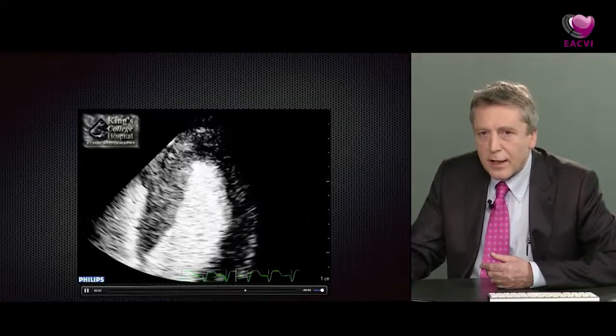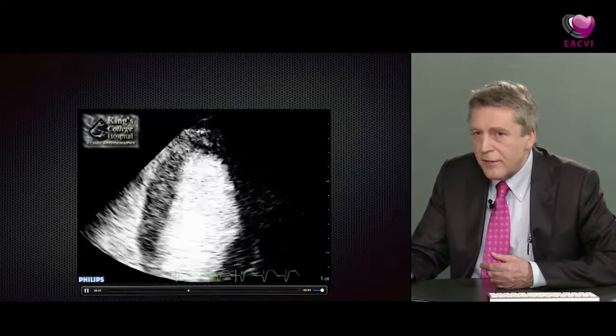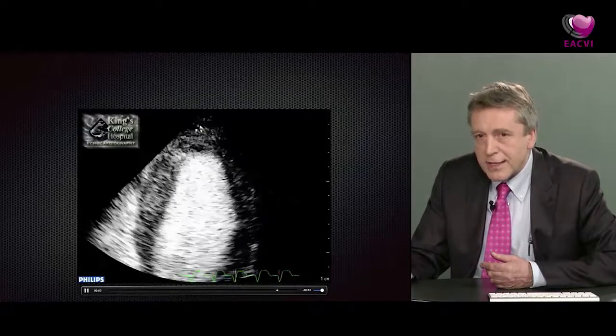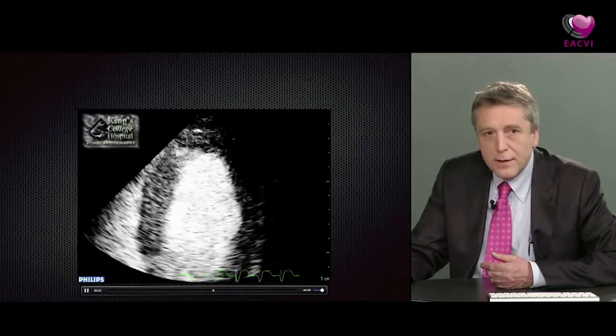And then notice here that the septum replenishes very, very quickly. But from this point here, at the midpoint and the apex, all the way around the lateral wall, there's very, very delayed reperfusion. So that tells us that the myocardial blood flow velocity is significantly reduced here.